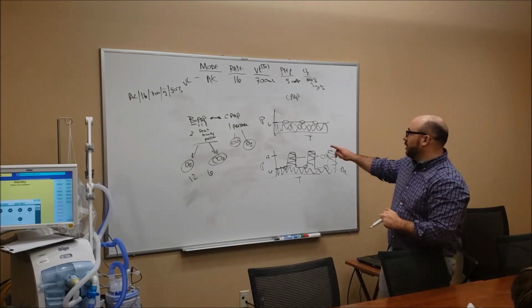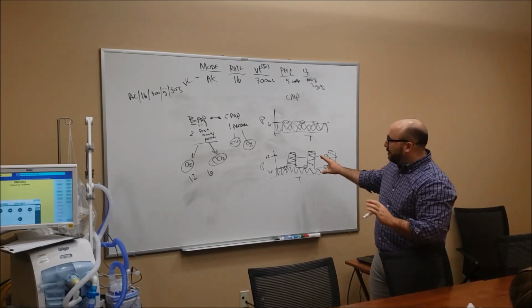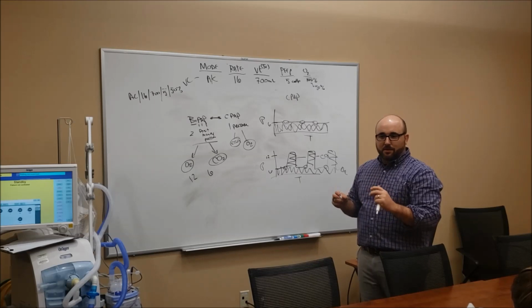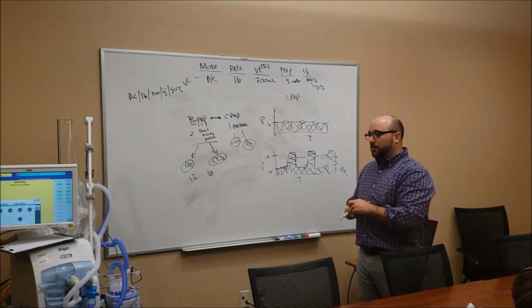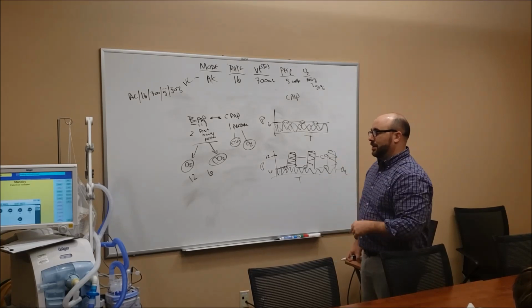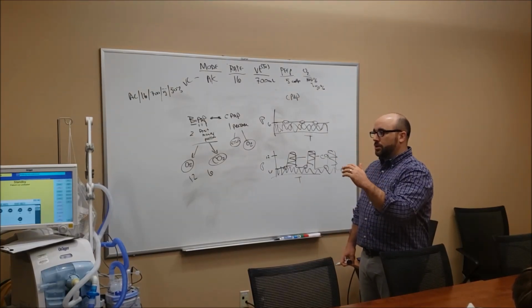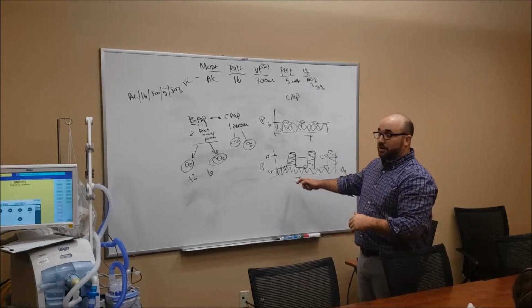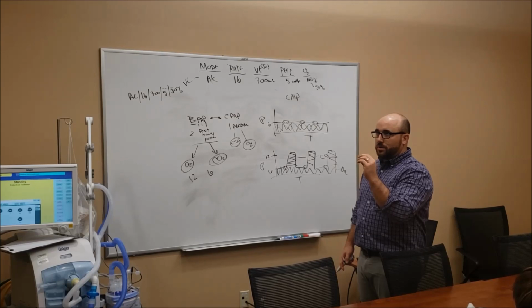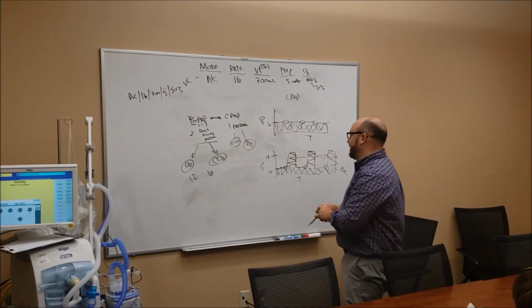A lot of patients don't like CPAP, so we'll just put them on BiPAP. If you came in with a pneumonia, BiPAP feels a little more normal for a patient when they're breathing. When you walk in the room, you don't have to see the BiPAP or the CPAP unit. You'll hear shh, shh. They're on BiPAP. There are 2 pressures there. If you just hear this one, that's CPAP. You can hear it. That sounds almost exactly like that.